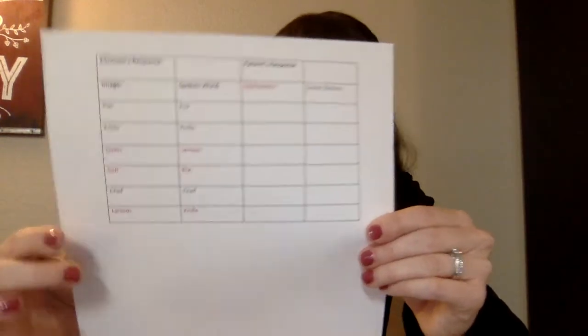When you're using tDCS, though, you pair it with something else. So I'm pairing it with an anomia treatment, in which I will use the same cards that I used for baselining for the actual treatment. Again, this patient loves to cook, so the 25 nouns have to do with kitchen supplies and ingredients. So I once again have all of these cards, and I'm only going to show 6 for the purpose of time. For the anomia treatment, I will then want a data tracking sheet that looks like this. I will go over this further.